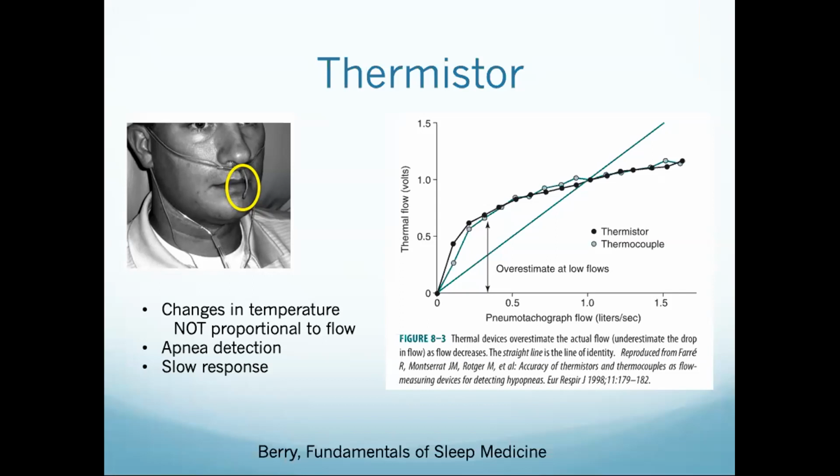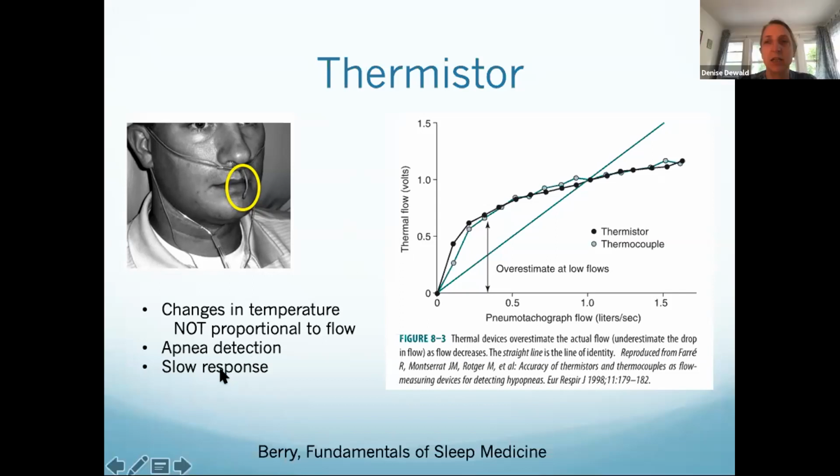Yep. And the other thing to know is that it's a slow response. Temperature changes are slow versus pressure changes, which are fast. So there's going to be a lag in this signal compared with the pressure.